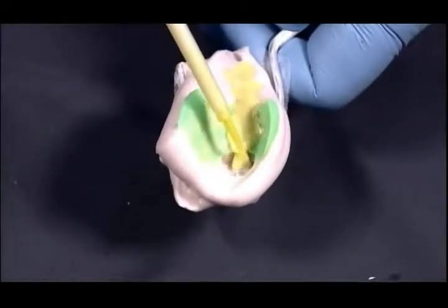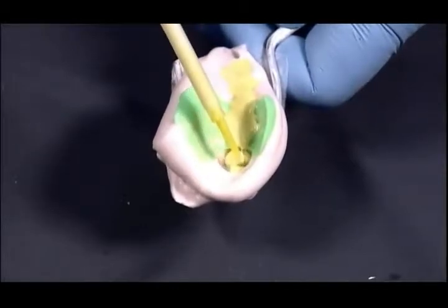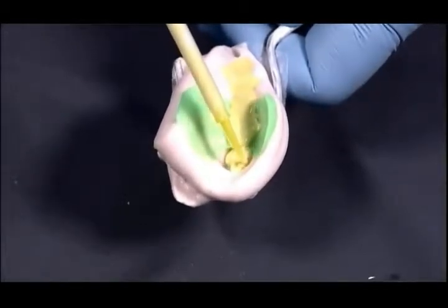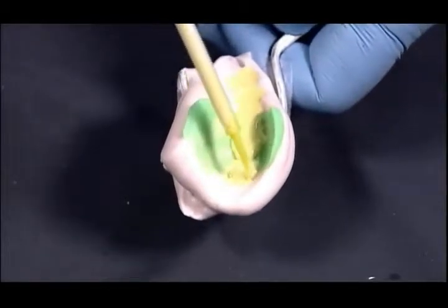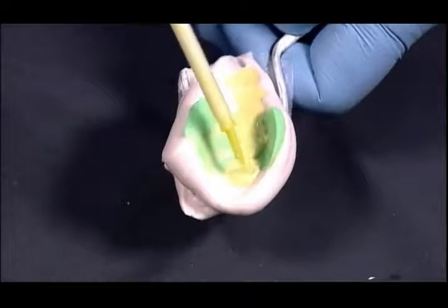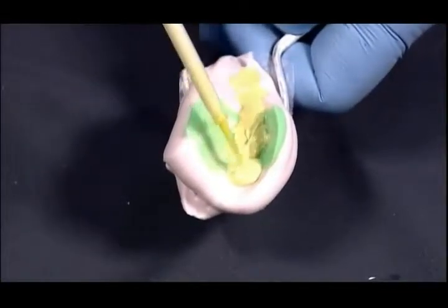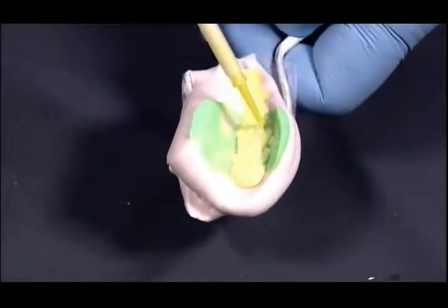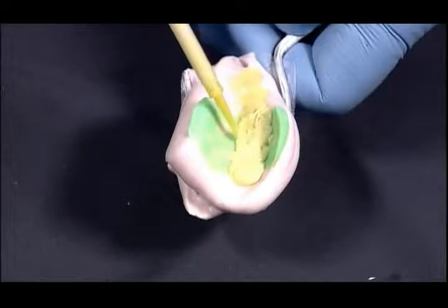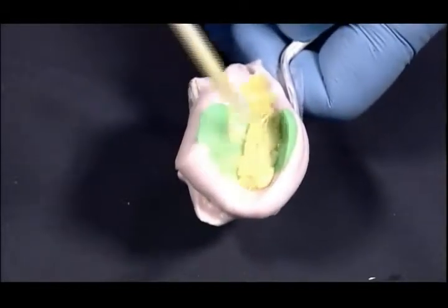model die making. This material sets extremely fast, and under studio lights it sets even faster. So I'm actually getting a very, very fast set on the material. I'm getting to the point where I can't hardly squeeze it out of there. In the operatory, and if you're at room temperature, generally it doesn't set quite this fast. All right, that gives you an idea of how fast the material sets.